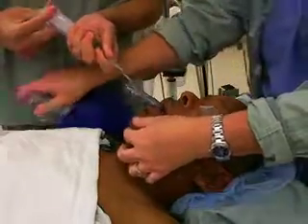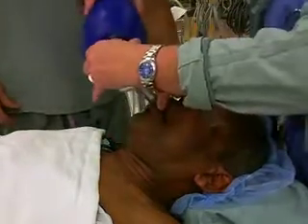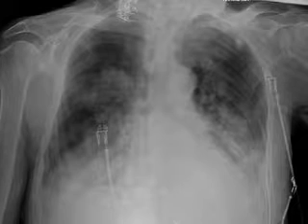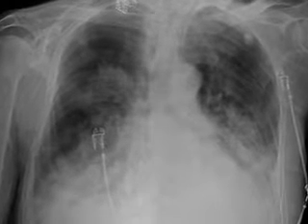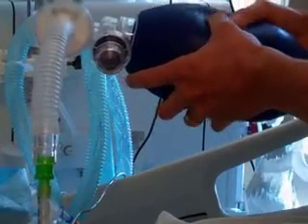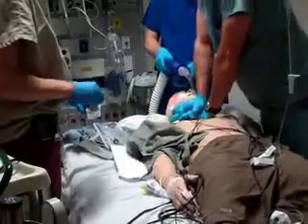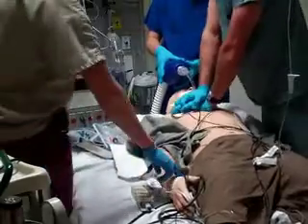Despite its numerous advantages for rescue ventilation, the laryngeal mask airway does not provide a secure airway and will not protect against aspiration when the volume of gastric contents is large. It may also be difficult to ventilate a patient with laryngeal mask airway when high airway or thoracic pressures are encountered, for example during vigorous chest compressions, or in obese patients, or patients with parenchymal lung disease.